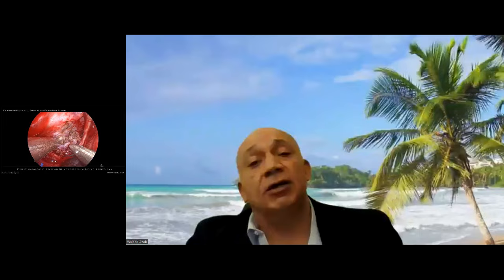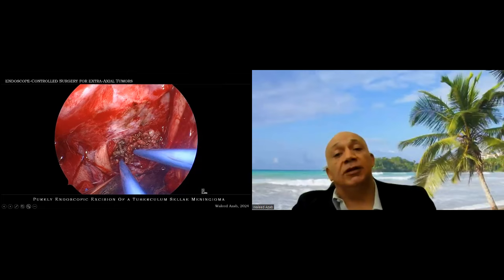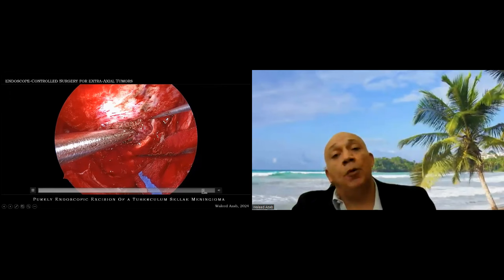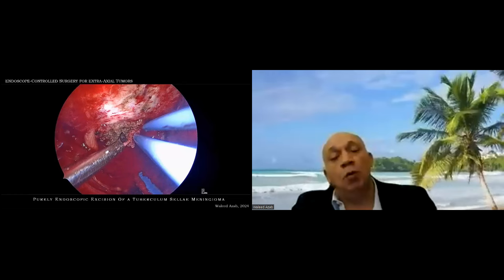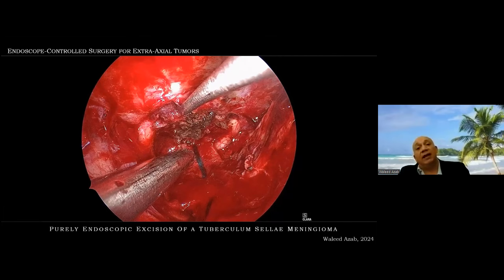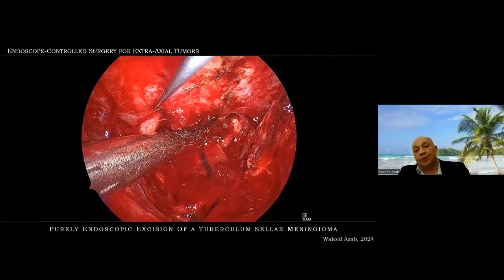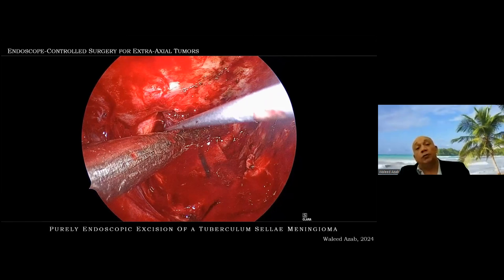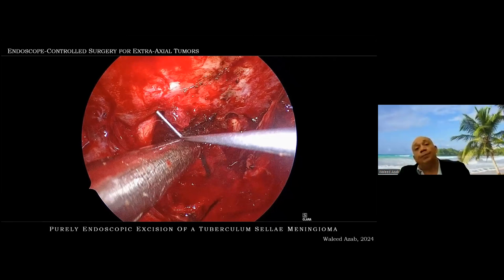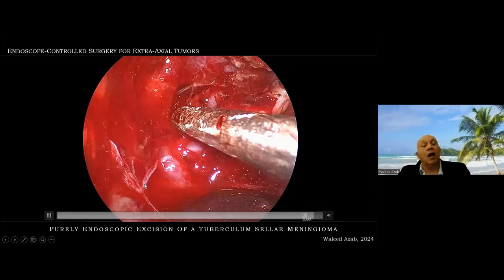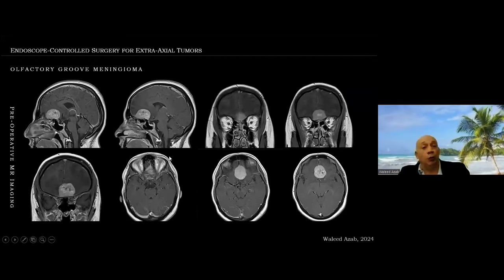Further development of the plane; the CUSA is used to resect the tumor. Microsurgical principles are applied using micro scissors, counter-suction, and bipolar coagulation for further decrease of tumor bulk. The anterior cerebral complex comes into view, then the left optic nerve, right optic nerve, and infundibulum. The intracanalicular component of the tumor is resected and mobilized on the right side, and the left falciform ligament is opened to mobilize the intracanalicular component on the left — a critical step for obtaining a good visual outcome. Post-operative MRIs show gross total resection, and she regained normal vision in about two weeks.